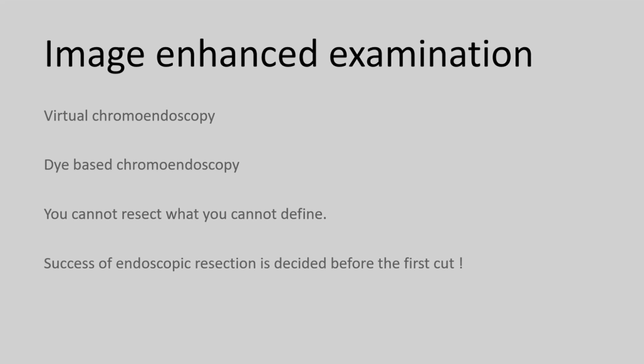It is important to use them because it helps in various forms. Number one, to delineate the margin. Number two, to characterize the lesion. And then decide how we resect the lesion. So the most important thing is you cannot resect what you cannot define. That's the bottom line I think we need to understand.